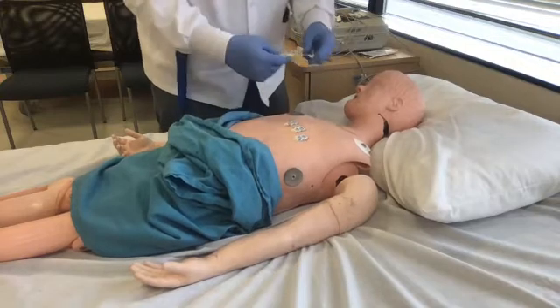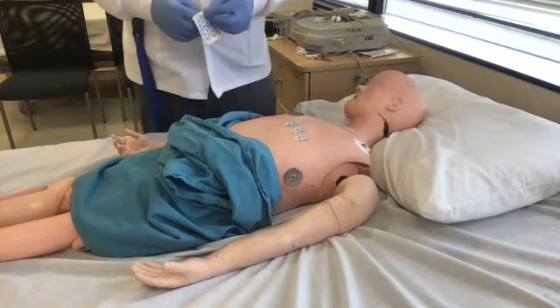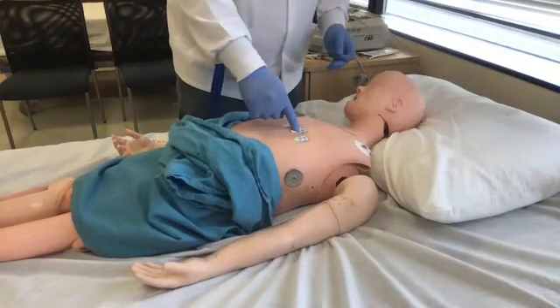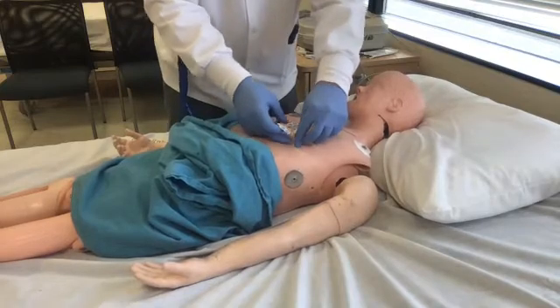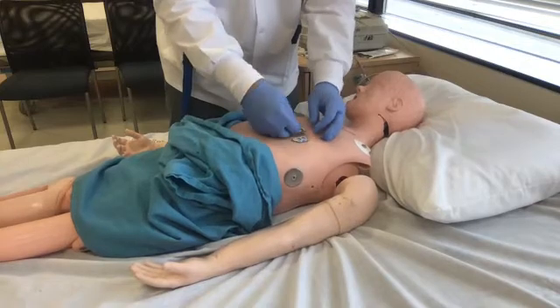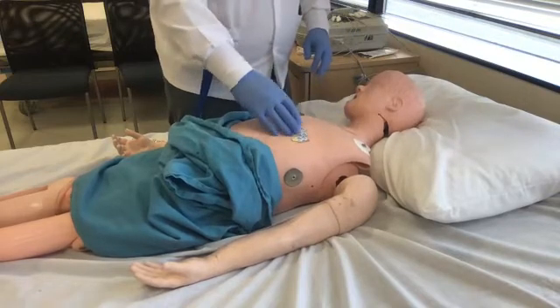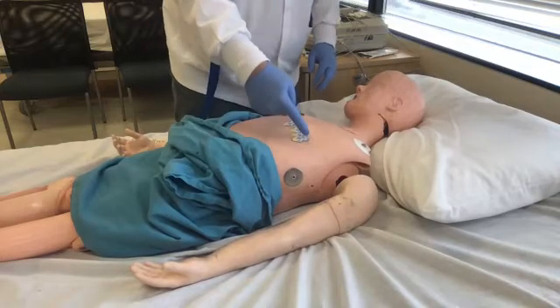So I'm here. Now, the answer on every EKG exam, where is the location of V3? The location of V3 is always in between 2 and 4. So what can you do? You can see how challenging it is now with gloves, right? So you see how it's starting to form an arch?